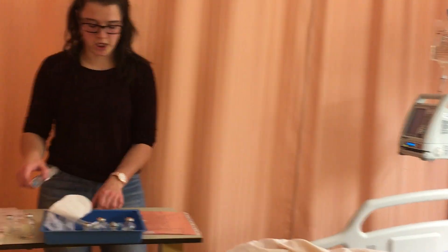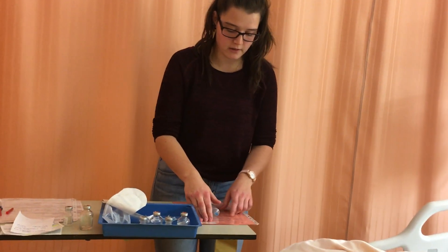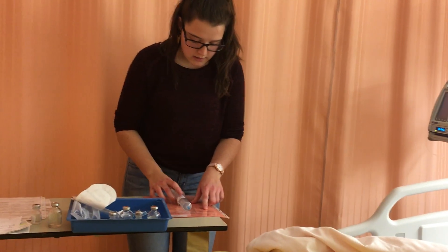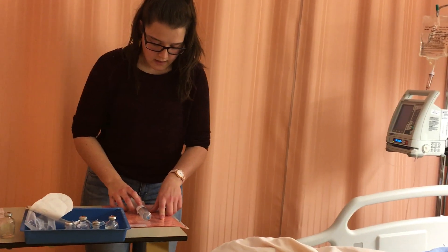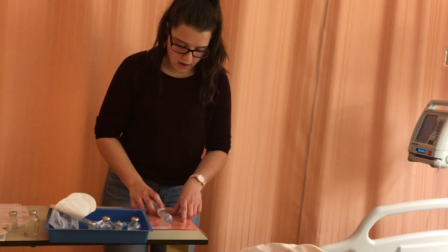I can do my third medication check at the bedside. Right patient. No allergies. Cloxicillin, 1000mg, correct. Via IV — that is what I'm doing. And every four hours, which is right now.